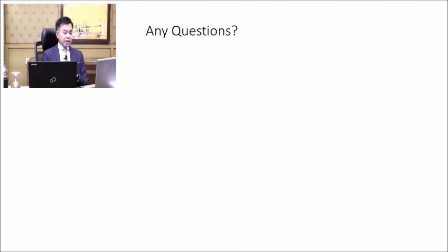My experience with the Symphony lens in post-LASIK patients, well, it's very good. The results are very good. We presented a poster at the ESCRS in Copenhagen last year. It was nominated for the poster prize. I think if you log into the ESCRS website, or if you email me, I'm happy to present that data with you in greater detail. But yes, the results are very good. What is my opinion on Symphony for diabetic retinopathy patients? I tend not to implant any premium IOL in patients that have established retinopathy. So that's my recommendation.